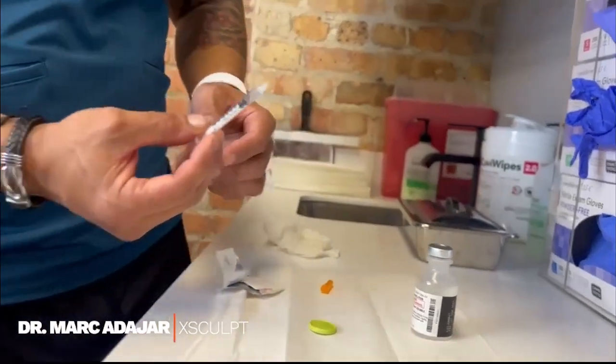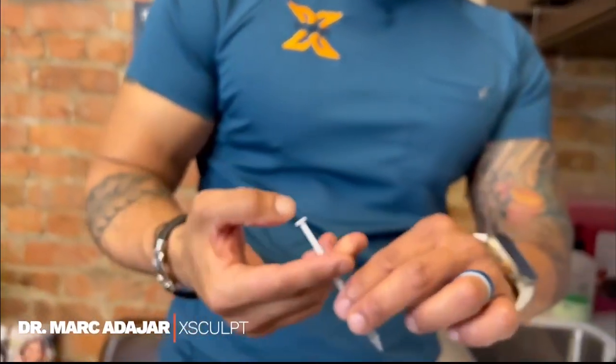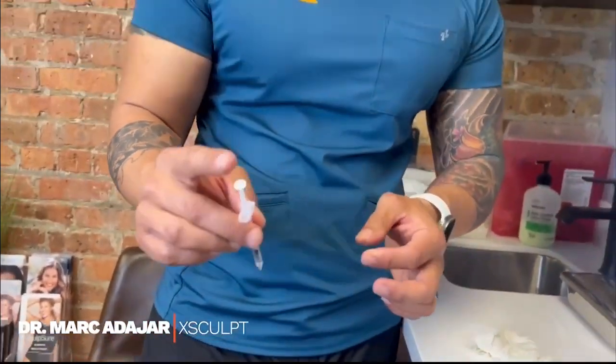When it comes to injecting, I recommend you hold it kind of like this — with your two fingers and then push down like this. You can also alternatively hold it this other way. Personally, I find it easier to do it the first way.